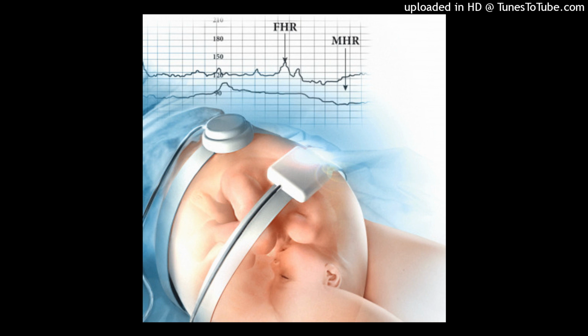Another IA method includes FHR counting in several 5 to 15 second increments. An increase in the number obtained from each 5 or 15 second count can indicate an acceleration, whereas a decrease in the rate can suggest a deceleration. An abrupt decrease in rate from the baseline should be followed with other measures to clarify the fetal condition, such as continued assessment or placement of an EFM device.